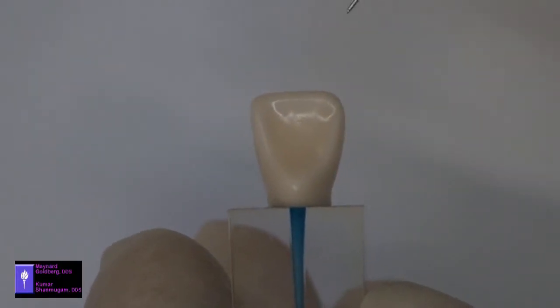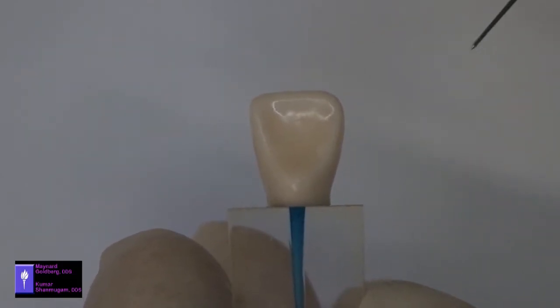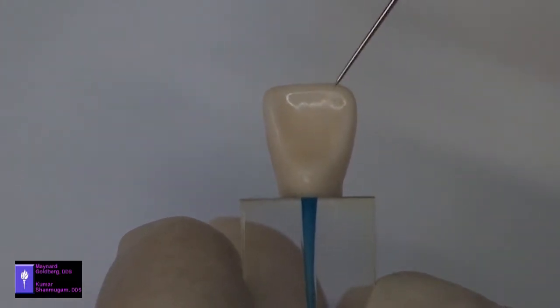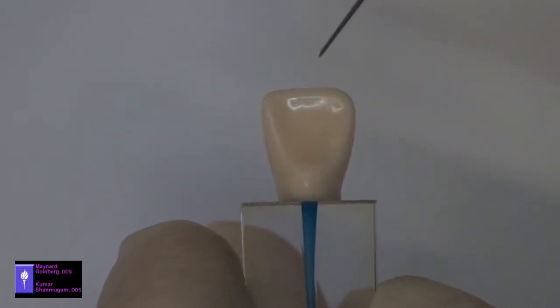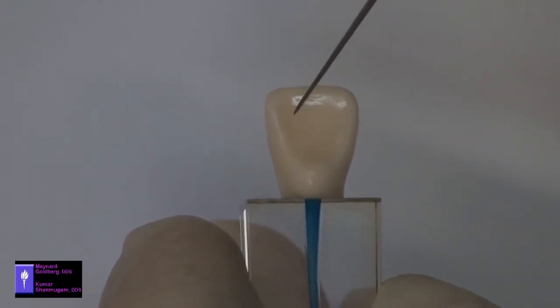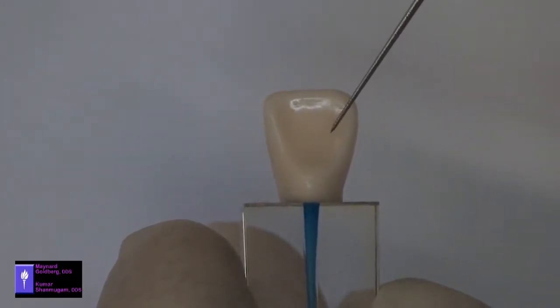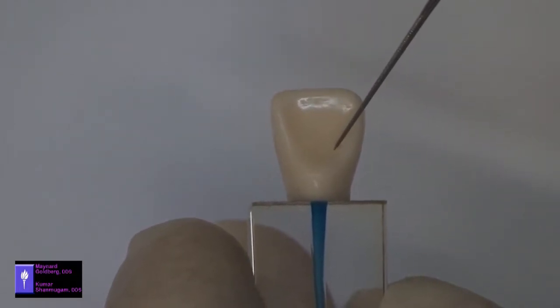If designed correctly, all access cavities will have some common features. The access cavity will take on the external shape of the tooth. For a central incisor, you could see that it is triangular in nature. The base, or the widest part of the triangle, being at the incisal end, and the apex, or narrowest part of the triangle, at the cingulum end.